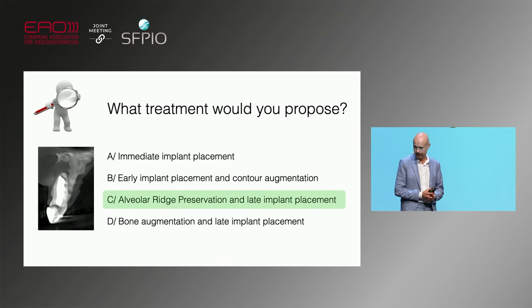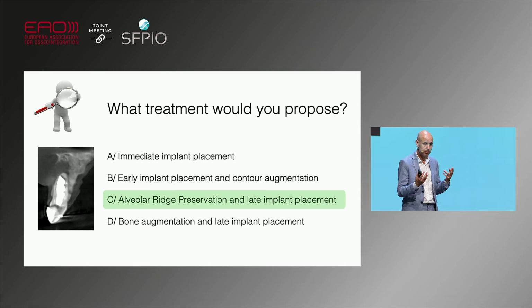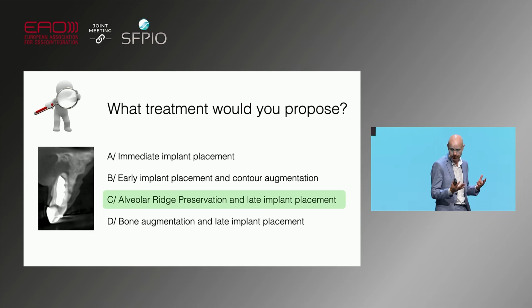Absolutely. Thank you. Well, I can imagine that you must have thought, Jan is coming, he will show an immediate case. But this is not an immediate case, of course. And Ignacio couldn't have made it easier for me, because he showed virtually exactly the same case a few minutes ago. We didn't consider apical surgery here, because that was one of the questions coming to us, because the tooth was very mobile also. So we had to go for tooth replacement.